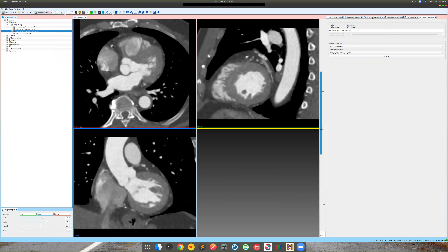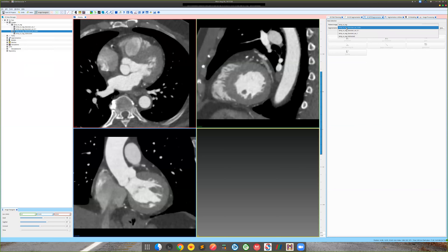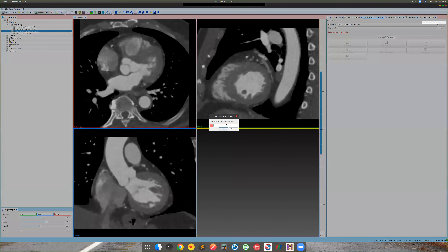Now that we have a filtered image, we want to invoke the MITK segmentation tool — the 3D segmentation tool currently available in SimVascular. There is a plan to introduce newer tools based on colliding fronts later, but for now the MITK segmentation is very powerful. Set the patient image to the filtered image. We need to create a new segmentation first — otherwise the options won't be active. Let's call it 'segmentation one'.